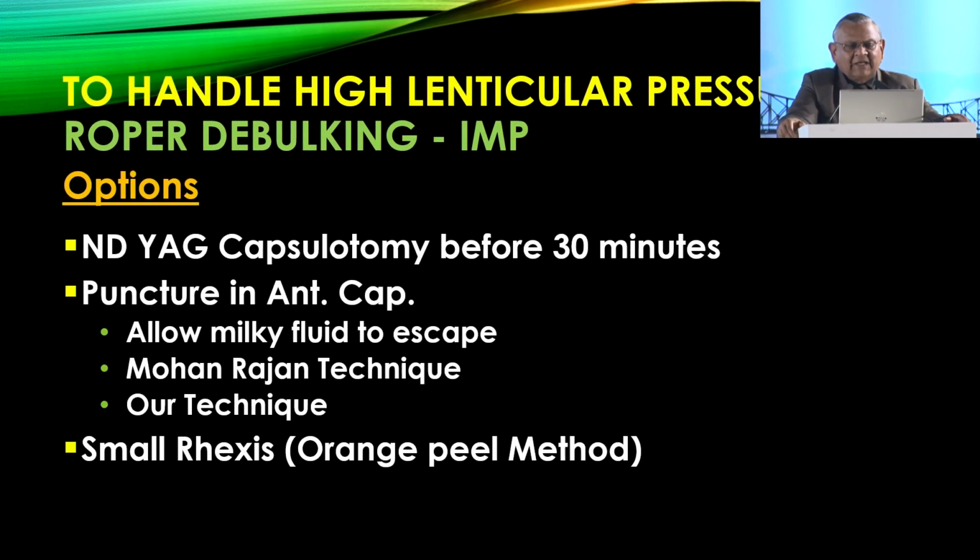Now, Nd:YAG capsulotomy used to be done in the past about 30 minutes before, to allow the fluid to escape from the lens space into the chamber, and then we would continue. But now there are a lot of advancements: you make a puncture in the anterior capsule and allow the milky fluid to escape into the anterior chamber. Or there is a very good technique by Mohan Rajan, where you use a 500 vacuum, particularly in the venturi system, put it on the anterior capsule, and with a thrust allow the fluid to be sucked into the probe.